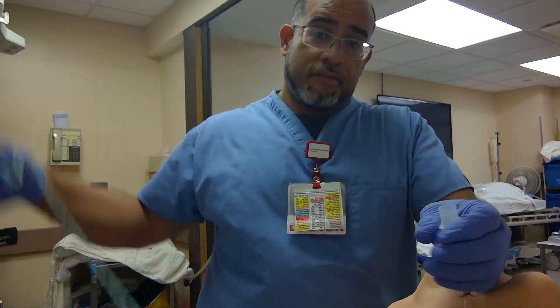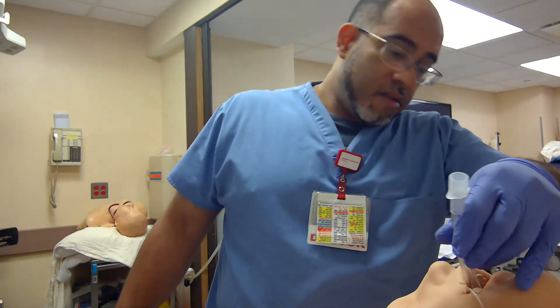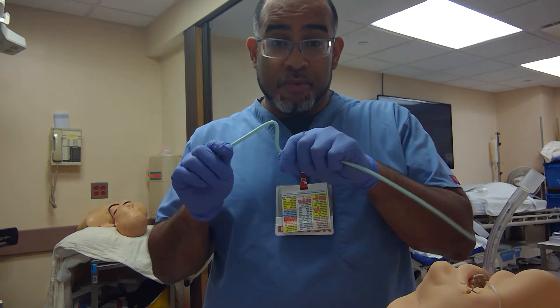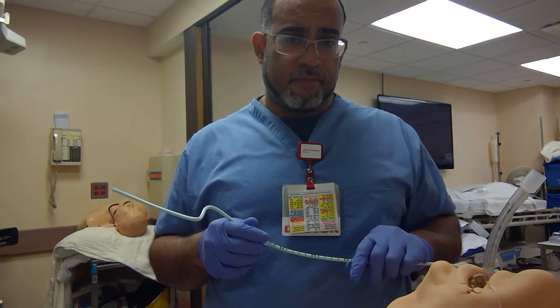Now disengage. A little deep at 26 — go back a little bit. Now 22, 23. You're set. The Bonju method is another way of manipulating the back end of the bougie to insert correctly. Make sense?